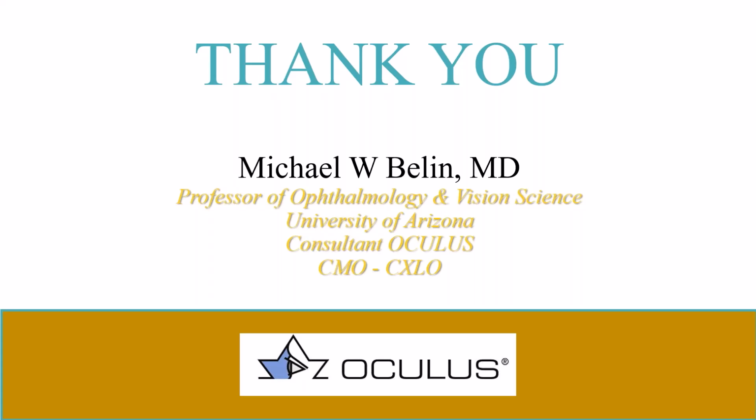Excellent. I've got another excellent question from a participant. Could you talk a little bit about the values that you look at in Final D as far as considering cross-linking? Yeah. So I am Chief Medical Officer of a company that is going to be starting very shortly our phase 3 on Epi-on. We use parameters from the Pentacam, but as I said earlier, the BAD by itself doesn't diagnose keratoconus.